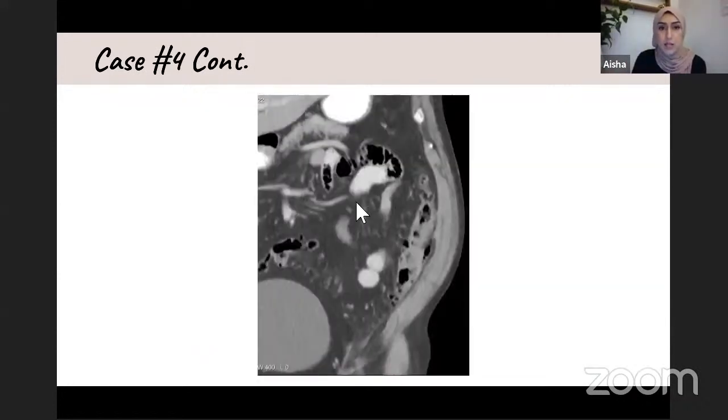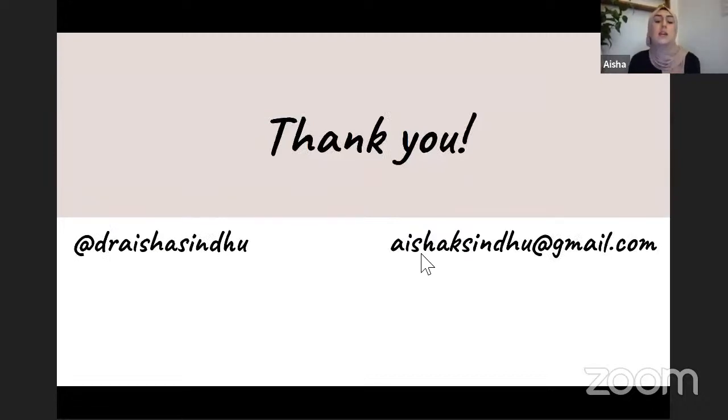And another complication of acute diverticulitis is perforation. So obviously, if you have an abscess, then you've perforated, but even if you don't have an abscess, you could still have perforation. So this locule of air right here on the lateral aspect of the colon, it's not within a bowel loop and it's not really within a diverticula. So this is actually a small amount of extraluminal gas, which implies that this is a case of complicated diverticulitis with acute perforation. So that's all I have for you guys.